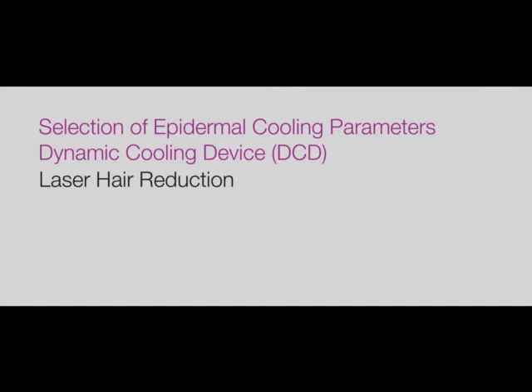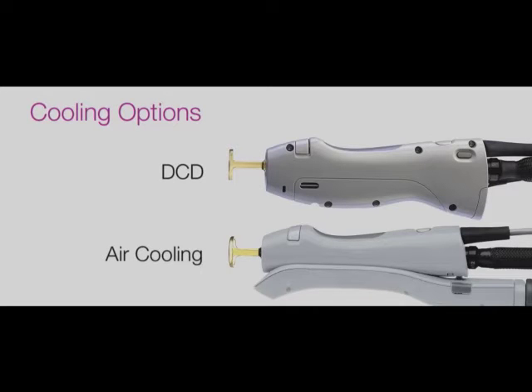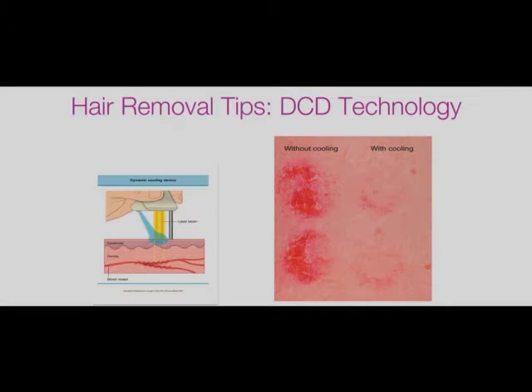Selection of epidermal cooling parameters. The GentleMax Pro has the option of air cooling or cryogen cooling. For cryogen cooling, parameters should be selected based upon the type of treatment, the spot size, and skin type.